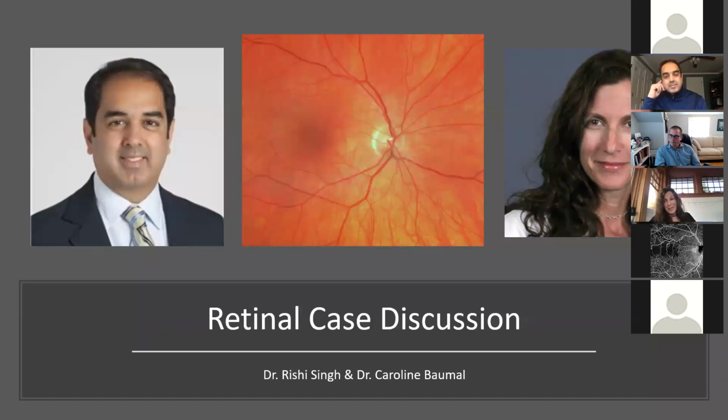Well, vision is always important. We like to have vision as a guideline because that's what all of our studies are based on. But in clinical practice, we probably rely more on OCT when we do our treatment, and there are lots of reasons for that. Patients come in and we don't always refract them or get their best vision the same way that we do in the studies. So I certainly use vision as a guide. Plus or minus a line is usually within the variability that people have, and patients often have more variations in their vision when they have AMD. Realistically, I use OCT as more of a guide when I'm treating people in real time.